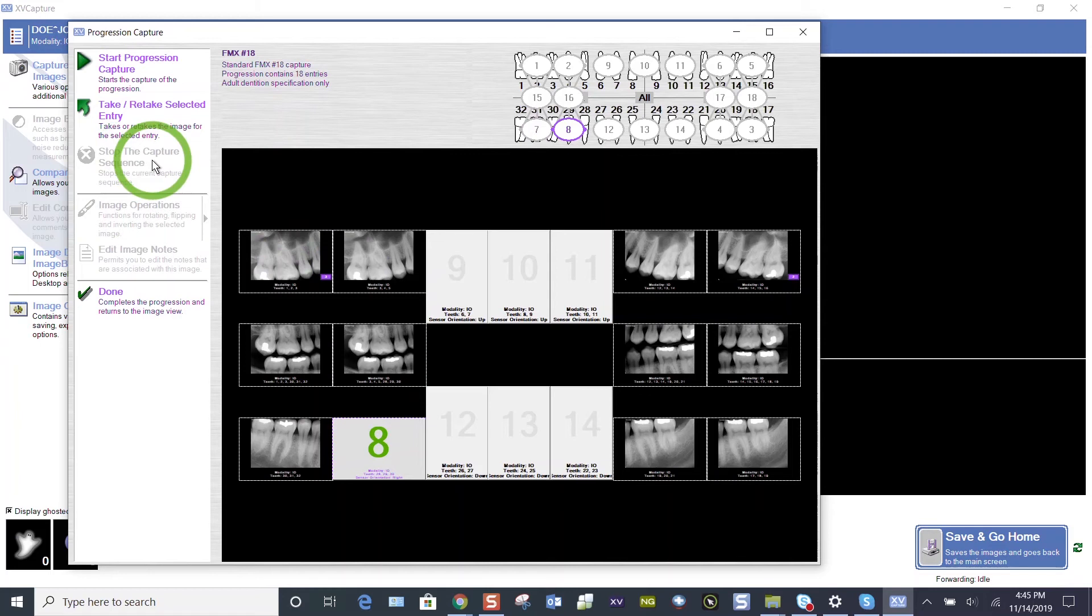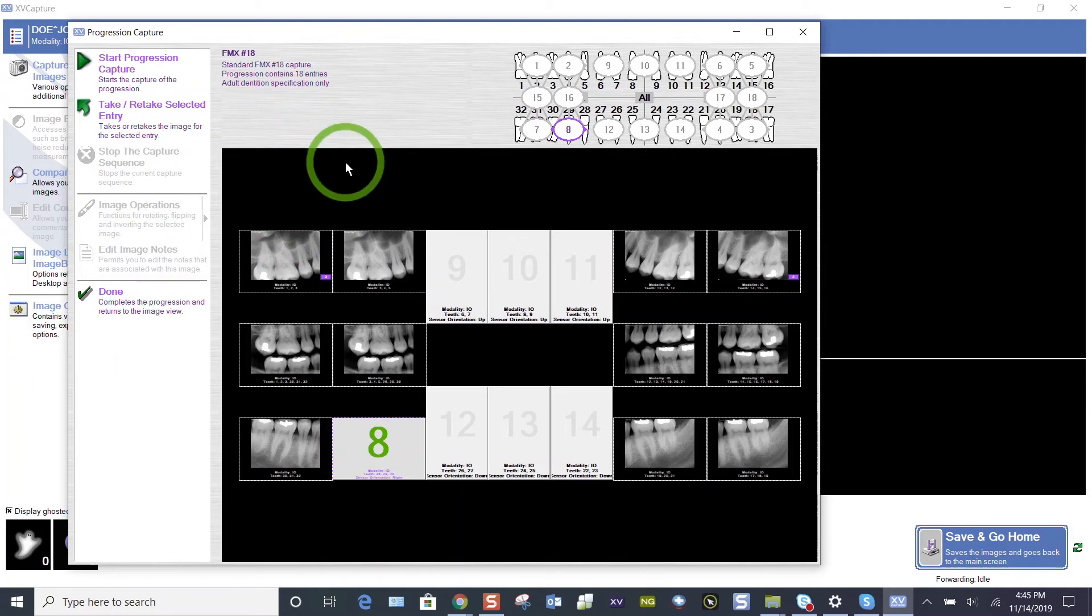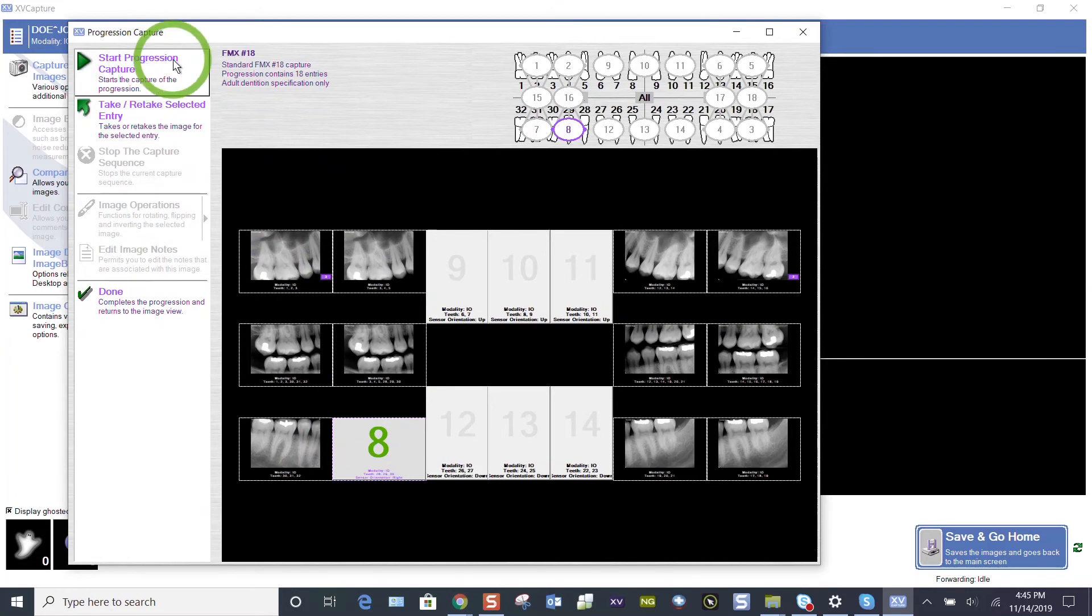If your patient has to get up and leave the room, go to the bathroom, take a phone call, and they're out of your room for five minutes, or if we are pulled away from our patient, that sensor will stay ready for five minutes. But at any point, if it gets into that unready mode, you can ready it again, pick up where you left off on that tile and start your progression again.